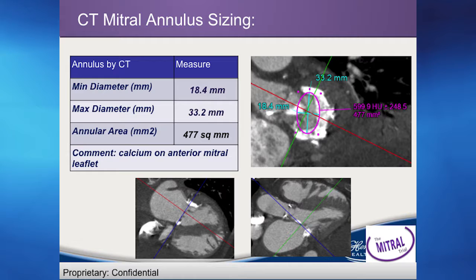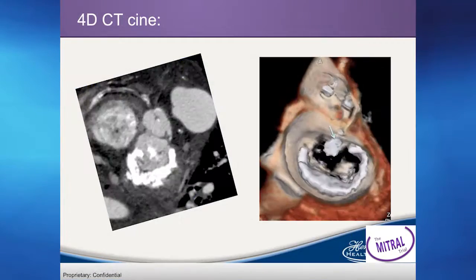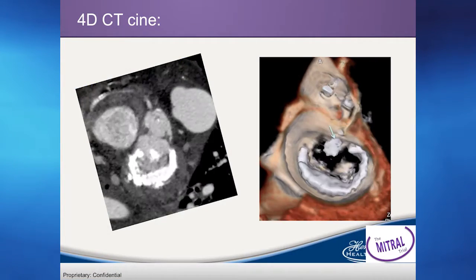And you can see we've carved up a little bit more space, but there's still some danger because when you put a valve in here, it still may obstruct. So we have to do some precise calculations and take some calculated risks, which will help work out in the patient's favor.